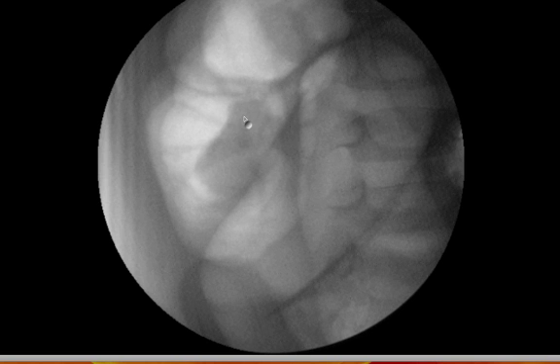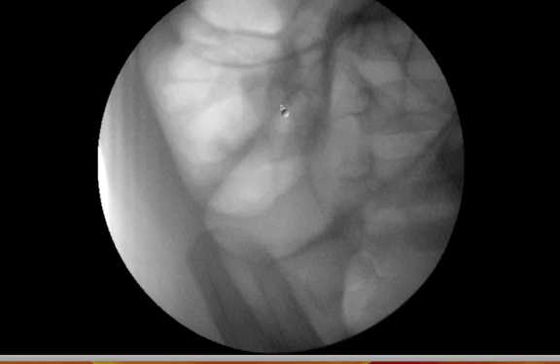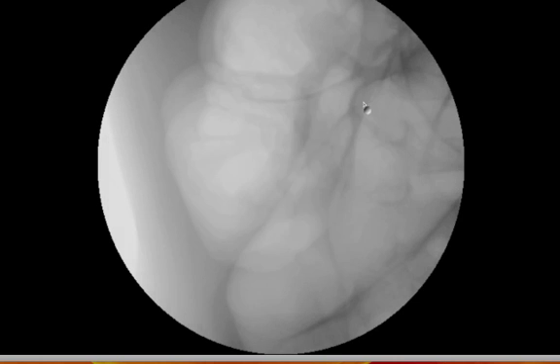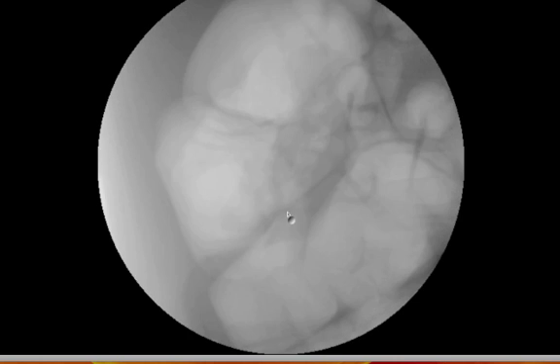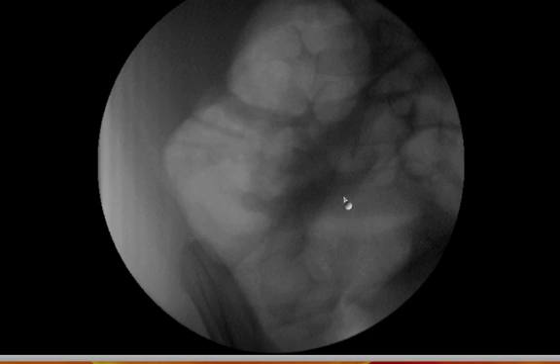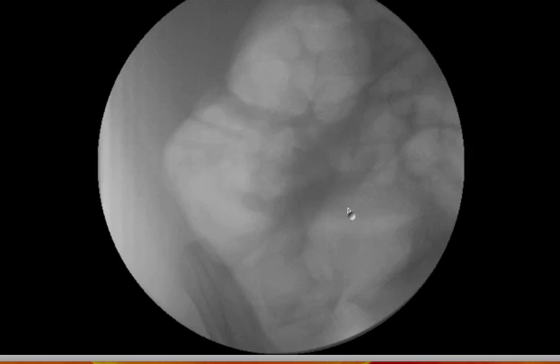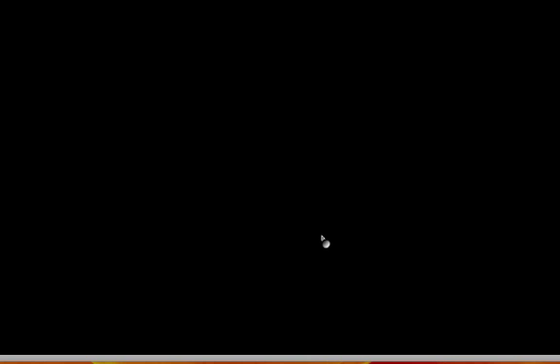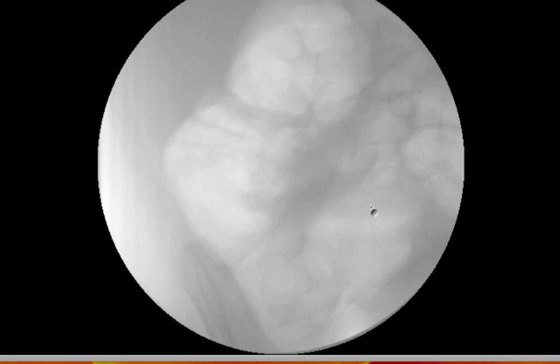That protruding intussusception is what we're concerned about — and all of a sudden, plop, it seemed to be gone. Another view, seemed to be gone. It was gone, and I was actually able to see under fluoroscopy that it had inverted and popped out. Very gratifying to be able to provide this procedure — parents are right there, and they're very appreciative. So this is an example of an intussusception reduction: the ultrasound findings and the fluoroscopic procedure.